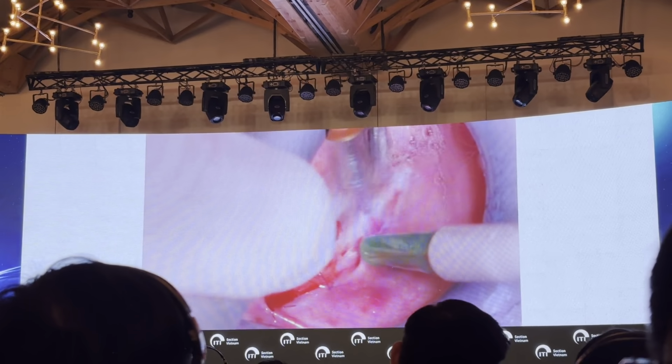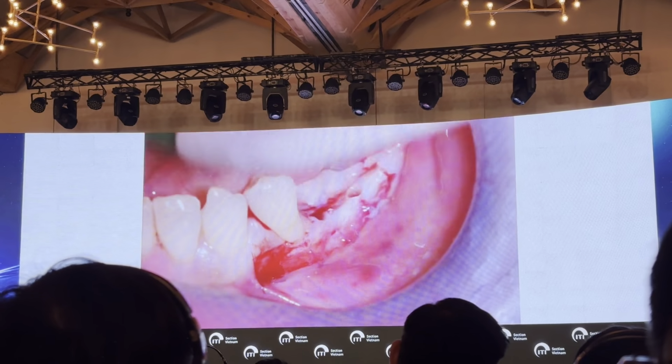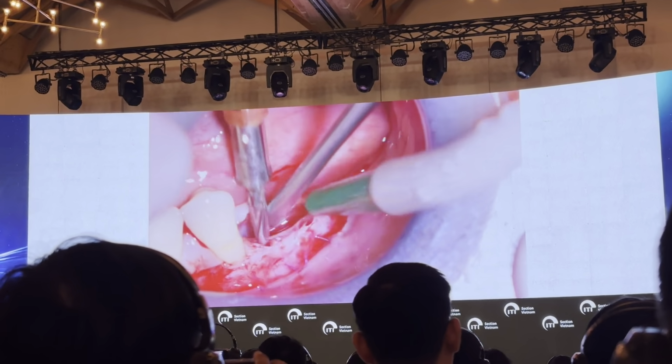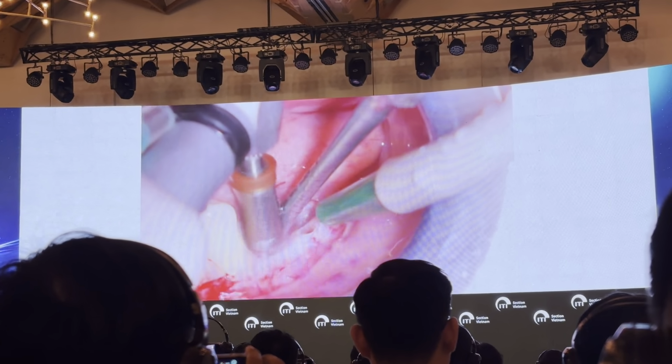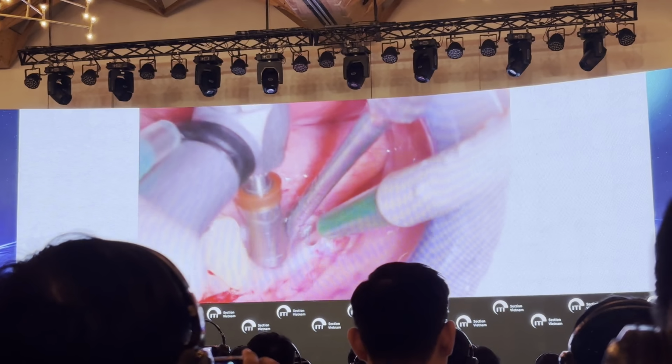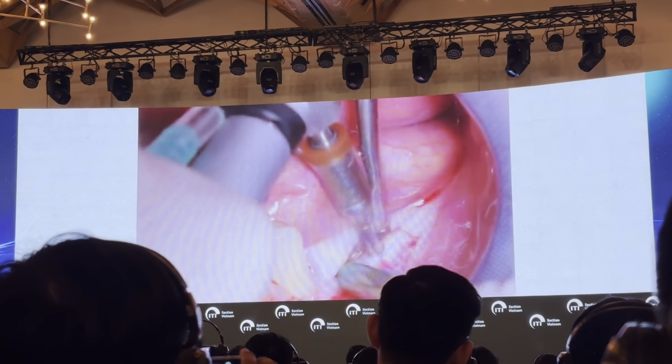The connective tissue graft in a bilaminar technique survives thanks to the vascular supply that derives from the covering flap. The free gingival graft survives thanks to the vascular supply that derives from the periosteal bed.